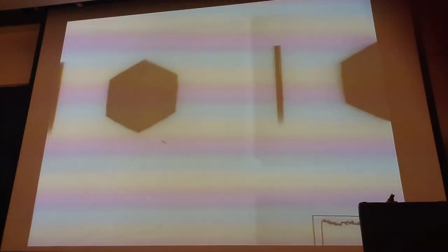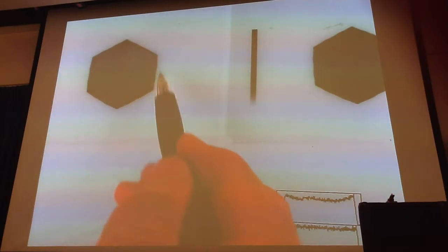Now, you don't see edge packing normally with this, and this isn't a very good image of it here. But like I said, there's a dark ring that usually goes completely around. Okay? But the other thing is doing it with what we call extrinsic uniformity. And here's a good example of one here.